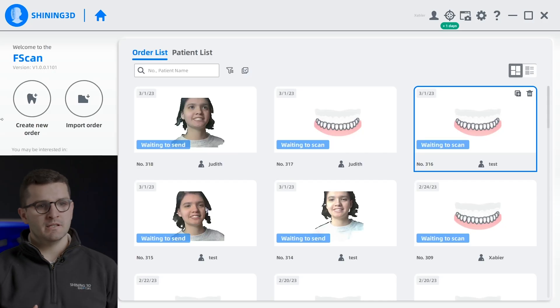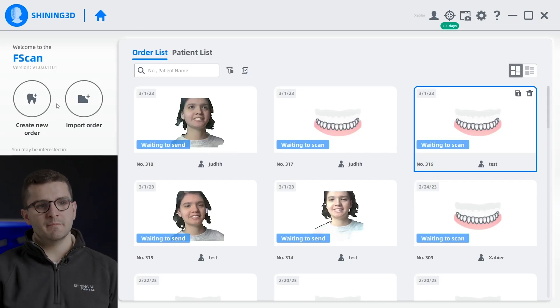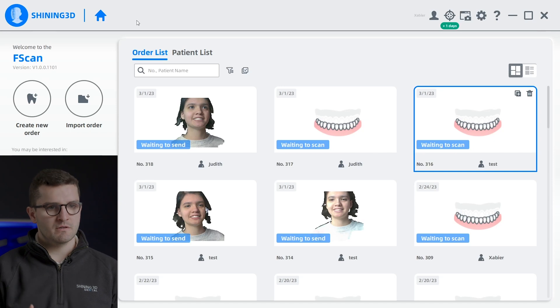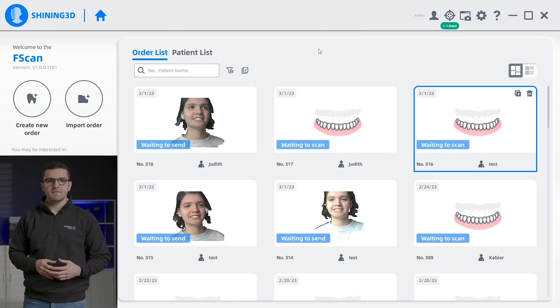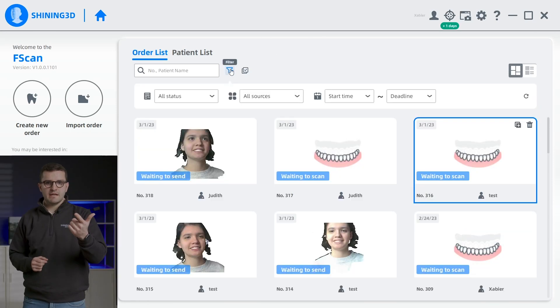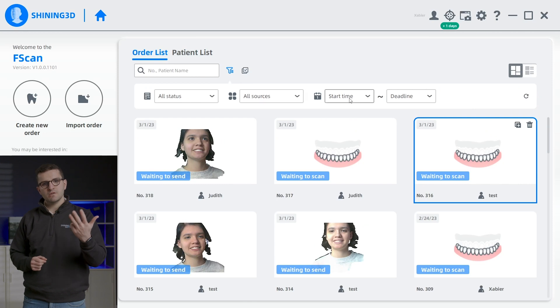Let's take a closer look at the software. Upon logging in, you will be greeted by a summary of your orders, which can be filtered by patient, status, source scanner, or date.